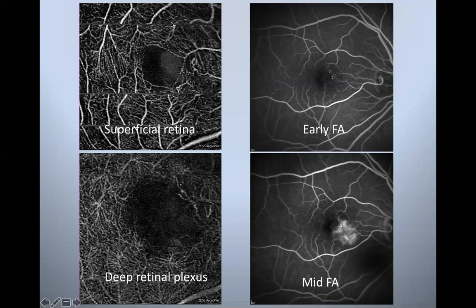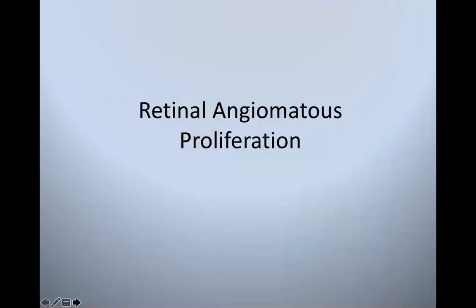You'll see the sort of gray linear horizontal line. But look at the blood vessels, they don't line up. So the blood vessels are like they've been shifted, like I took this entire middle portion and shifted it over about a couple millimeters. So it throws all the blood vessel connections off. Some patients, you can't get them not to move because they don't realize they're doing it. It's microsaccade. You have to just basically accept what you can and go with the image that you can get with that difficulty. So let's talk a little bit about RAP lesions.